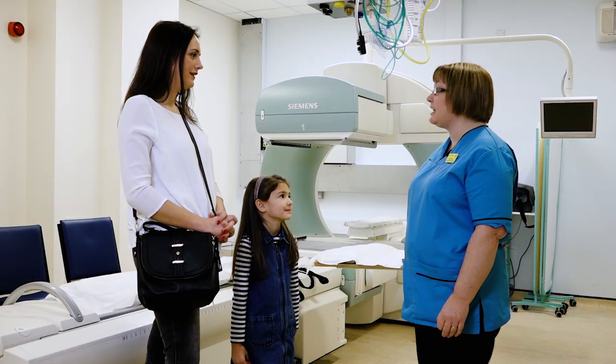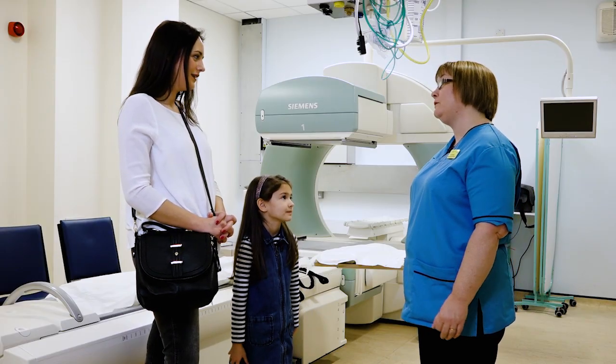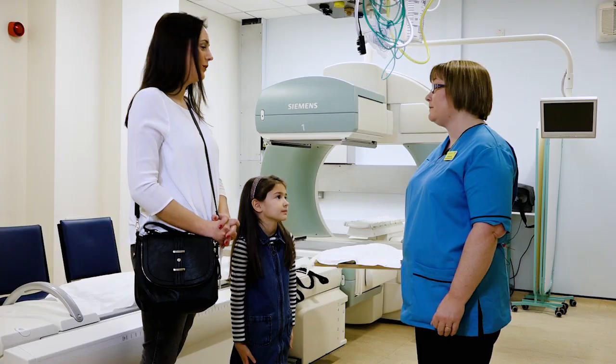Now we need to ask mum a few questions. Is there any chance that Scarlett has had any infections in the last six months? Does she have any allergies that you know of? And is there any chance that anybody in the household might be pregnant? The reason we ask about pregnancy is that Scarlett is going to have a very small amount of radioactivity for the scan, and we don't like people who are pregnant to be beside radioactivity.